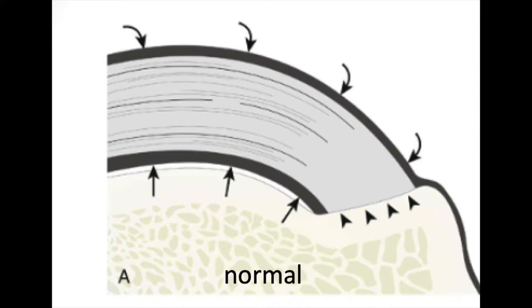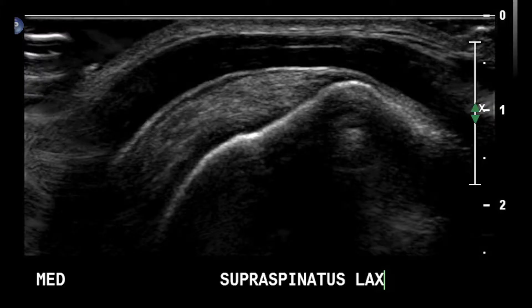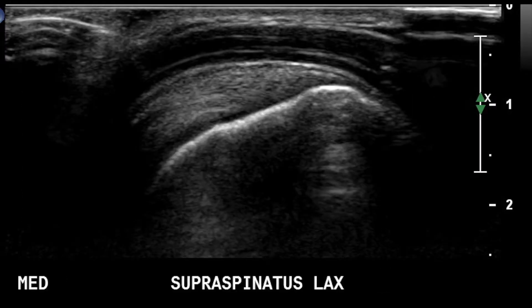Let's see here what a normal one would look like — nice fibrillar pattern. You could actually see the tendon attaching all the way down to the bone. Let's look at another normal to get oriented: supraspinatus, nice fibrillar pattern with no irregularity.